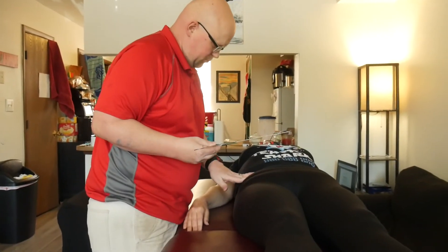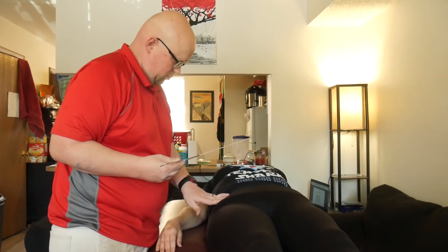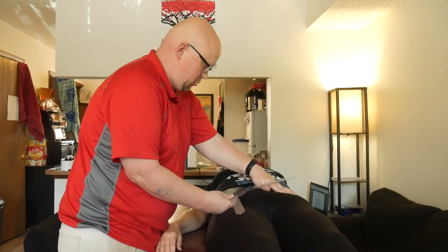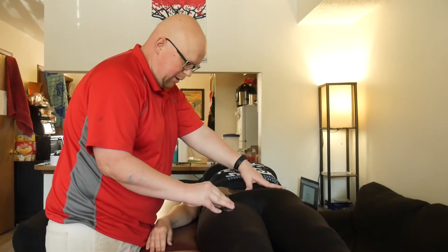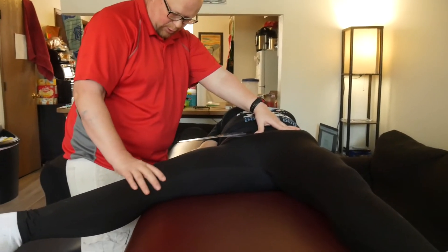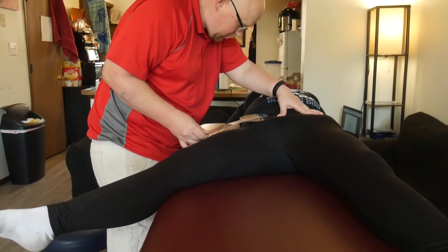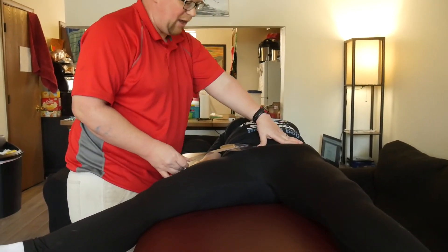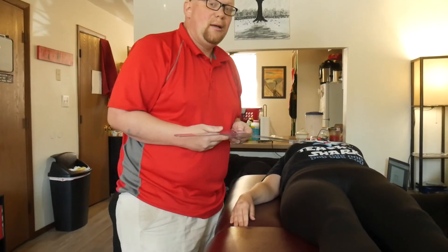Let me find those landmarks again. Right there — and then mid-patella. Go ahead and do that action for me, please, Karen. I'm just going to follow it out. Try not to rotate if you can. She has actually 45 degrees, so she's a little bit hypermobile there, but that's normal — there's a little variation between person to person. And so that's how you do hip abduction.